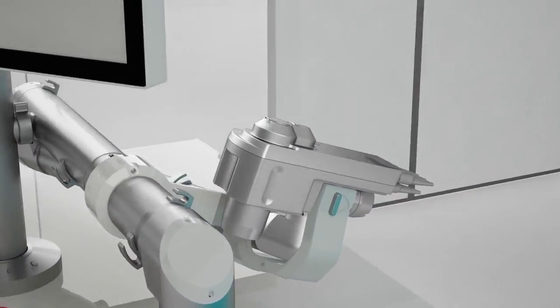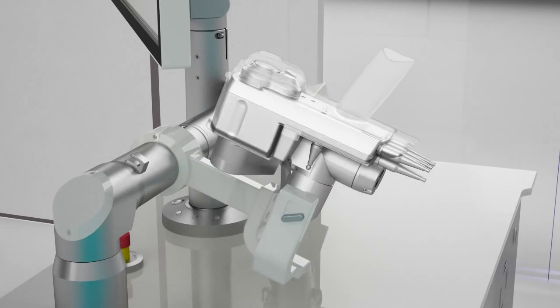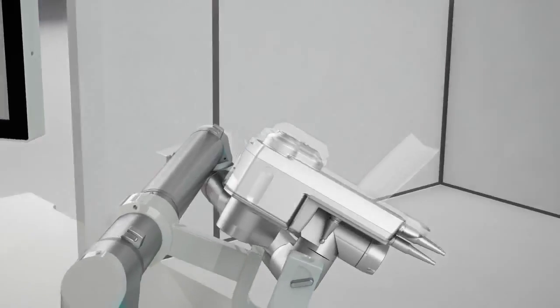Lastly, a simple and fast docking can be achieved manually thanks to the flexibility of the handpiece and an easily maneuverable articulating arm.